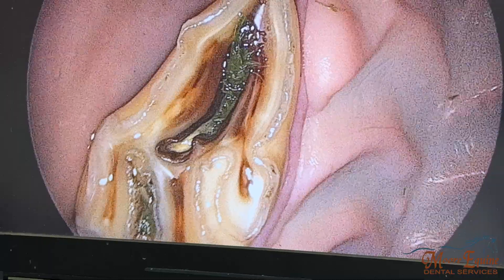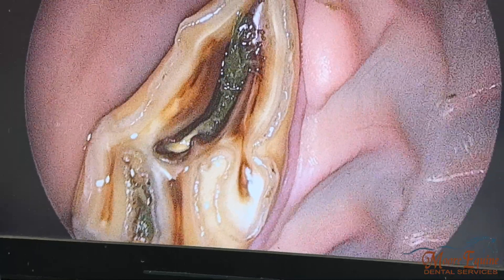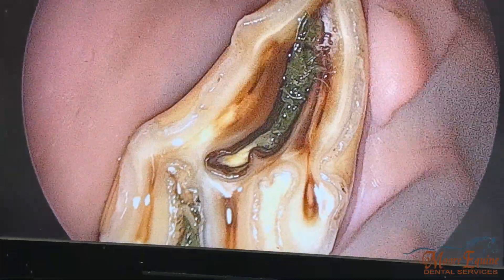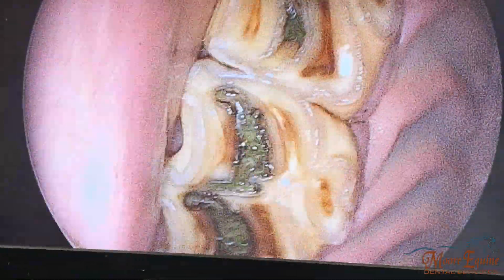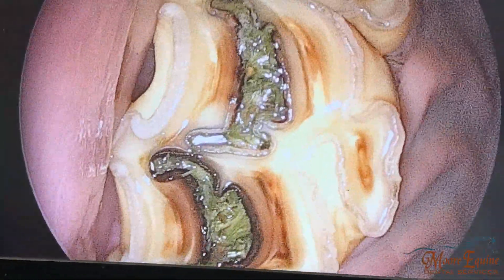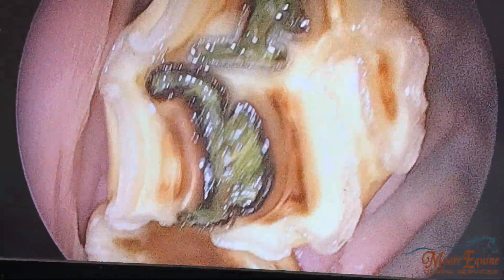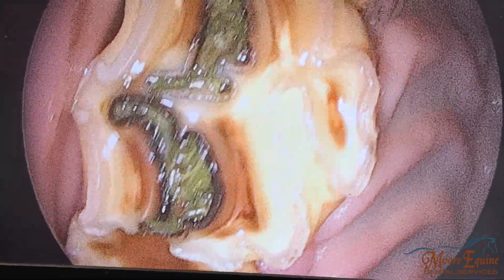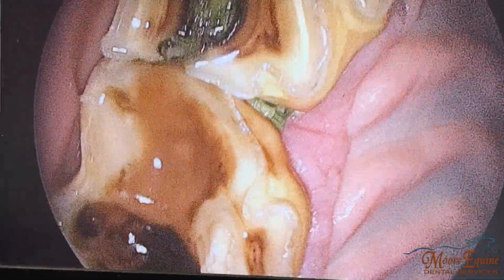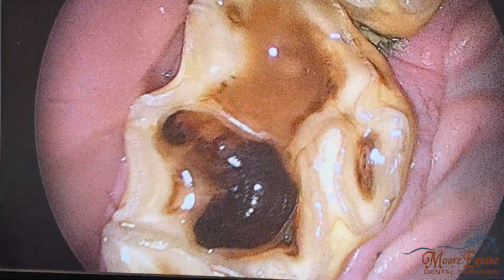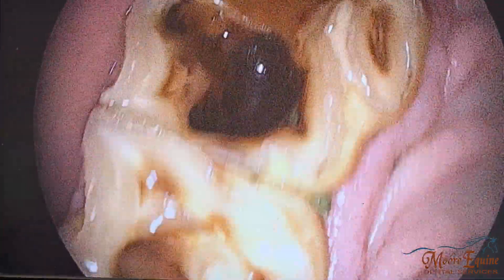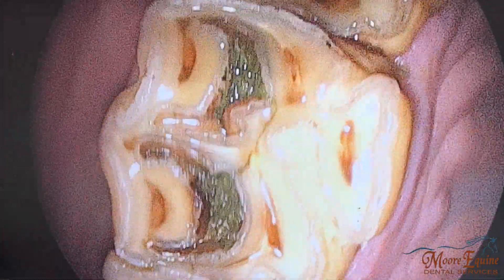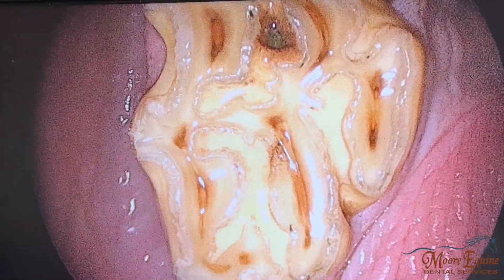Here we can see we've got an infundibular caries on the number six tooth, and then we also have pretty significant grade two and three infundibular caries on the 107. The 108 has an expired infundibular region, the number nine is expired, and number 10 has some grade one infundibular caries.